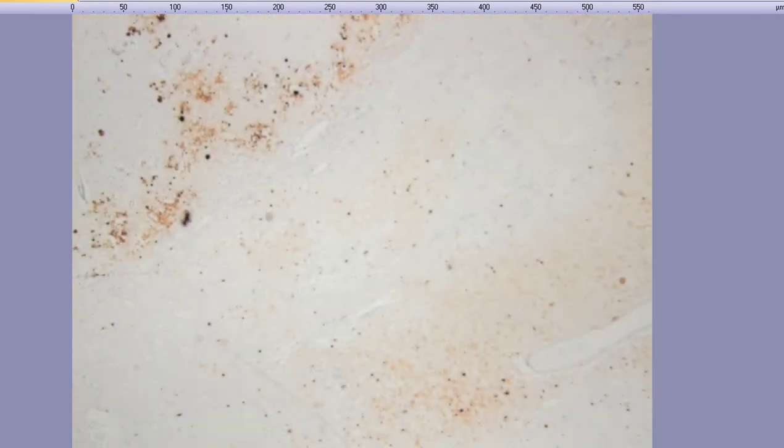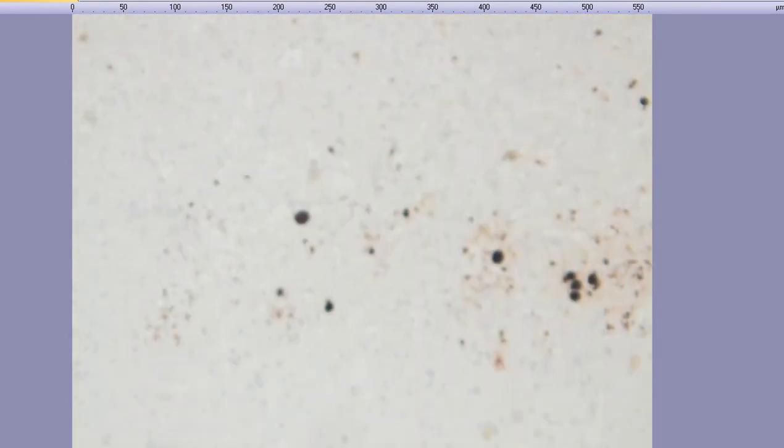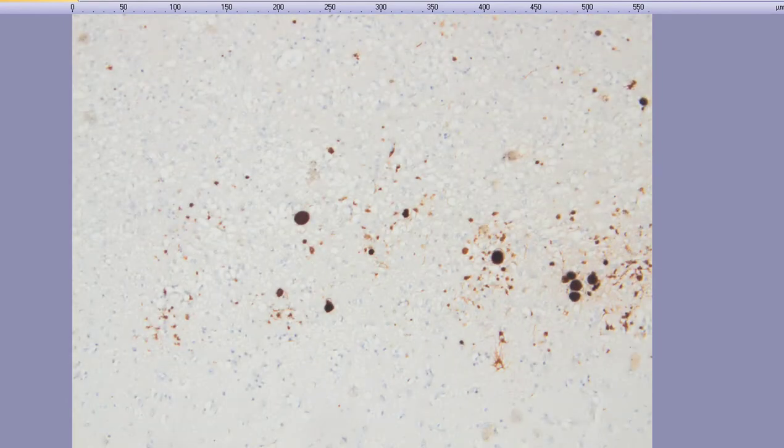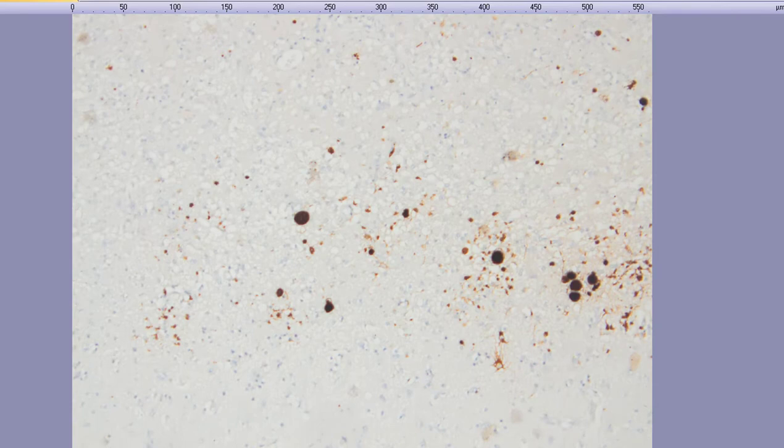At low power, you can again appreciate that at the periphery, you've got these encased bradyzoites.